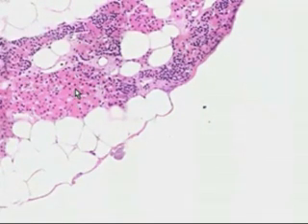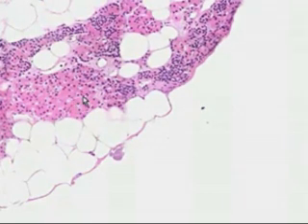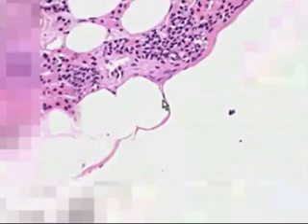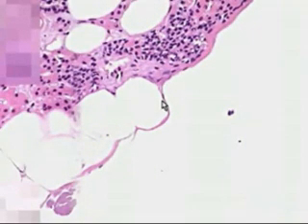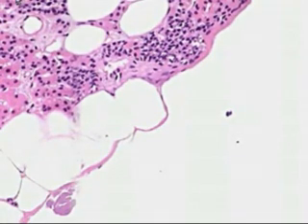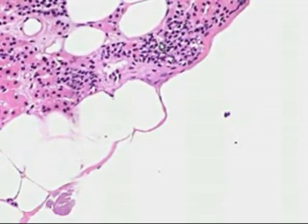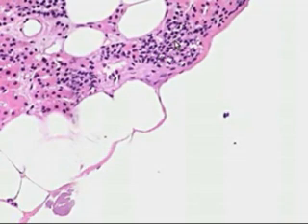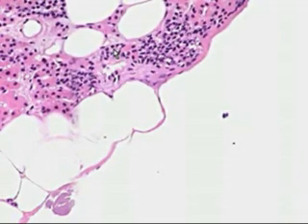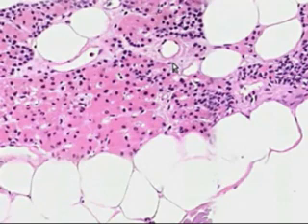They have a lot more cytoplasm, and otherwise the nuclei of the oxyphil cells look a lot like the nuclei of the chief cells. But the oxyphil cells have much more cytoplasm, and the cytoplasm is much redder. So all of these critters here are oxyphil cells. And all of these guys, and we're at the highest power, looking a little bit more boring, are the chief cells.